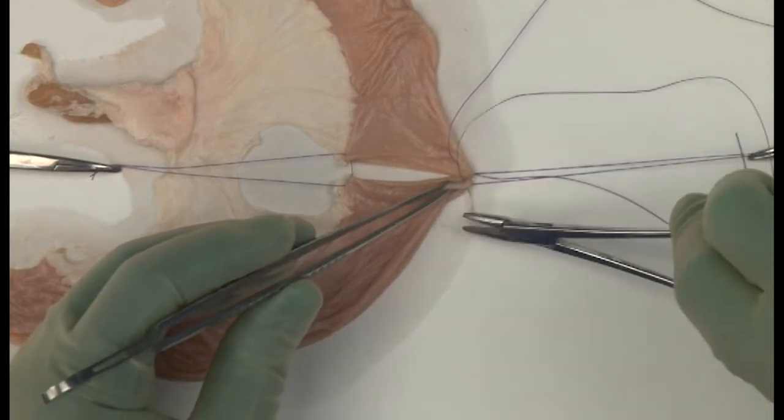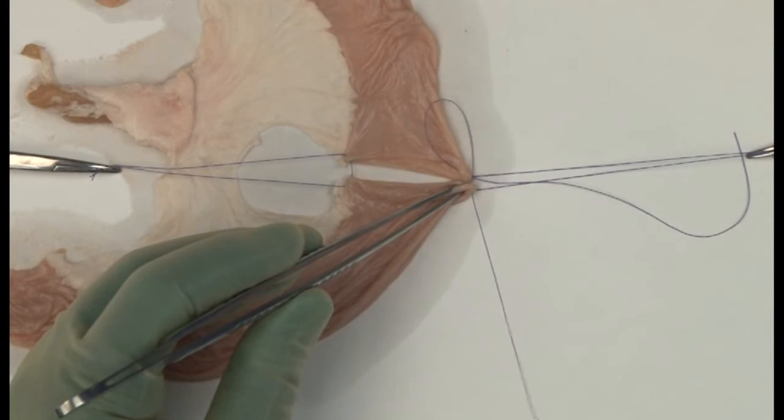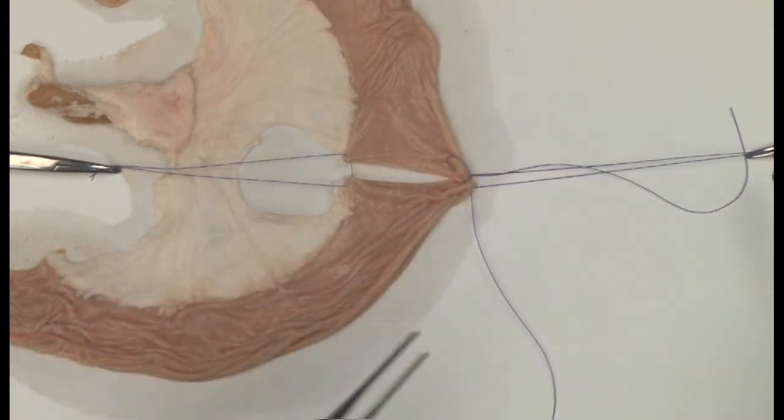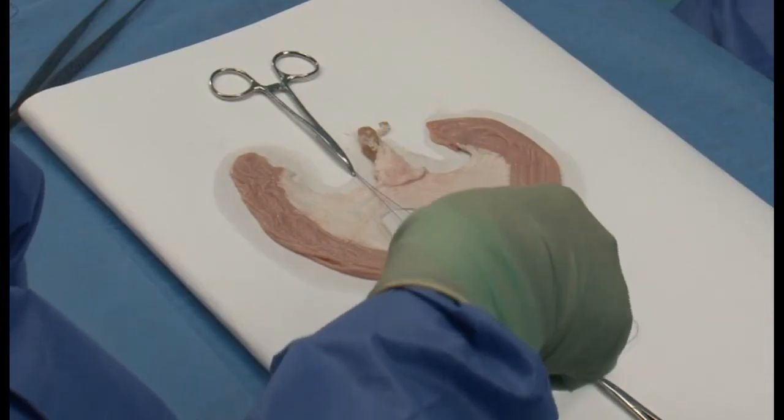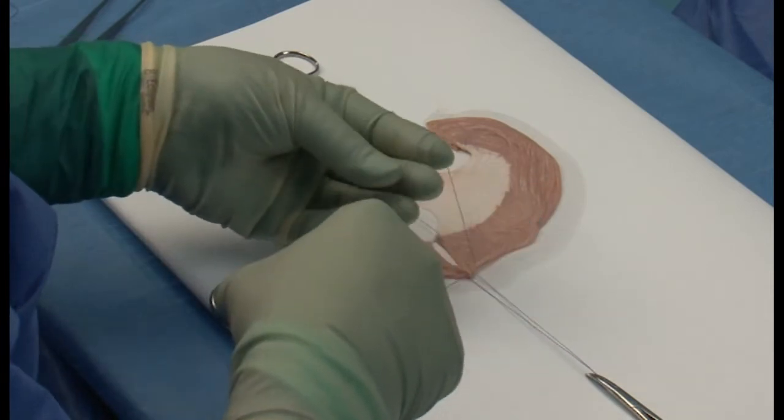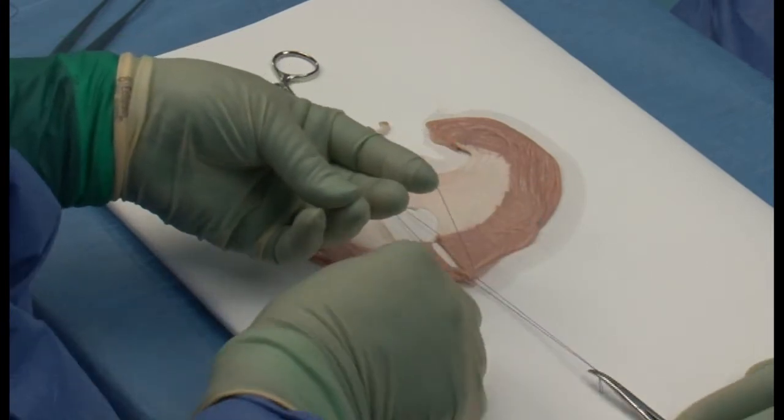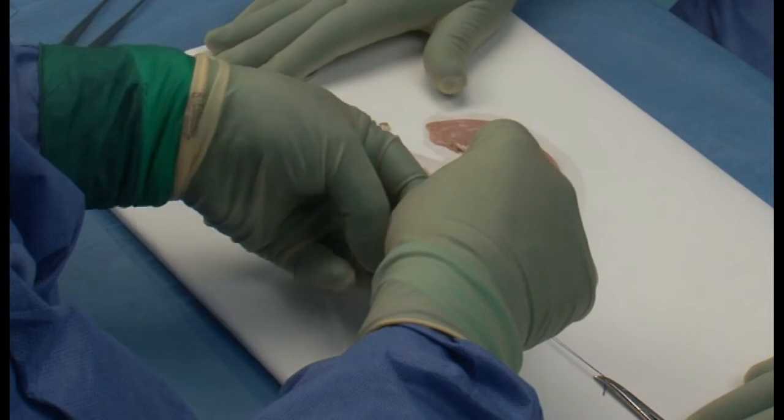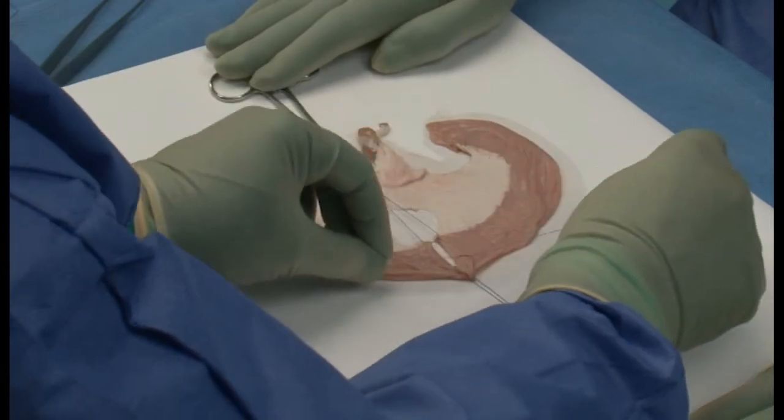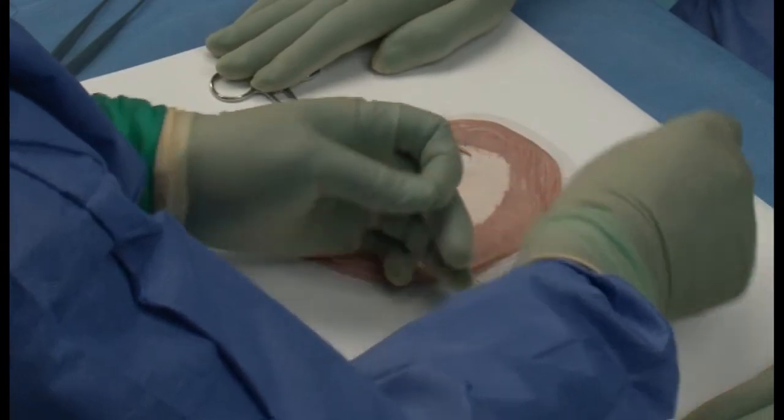We will start again at the anti-mesenteric border, and insert a suture approximately 5 mm from our original stay suture. Do not tie the knots too tightly, as this could cause strangulation of the tissues, and yet not so loose as to allow the potential for leakage.